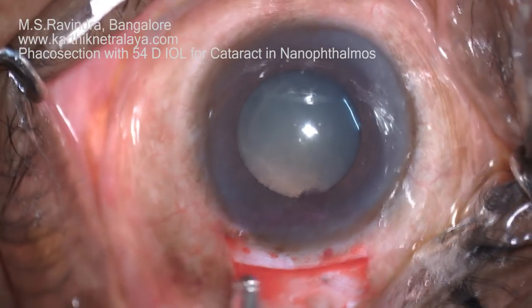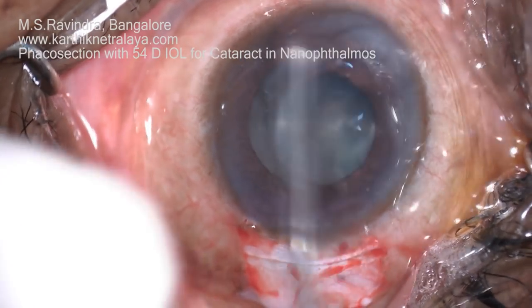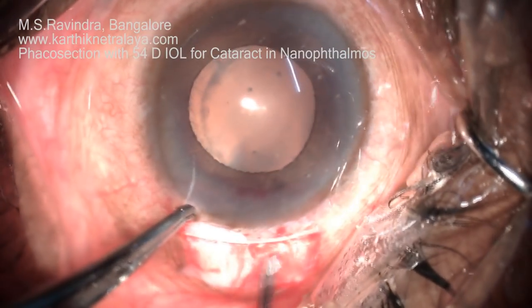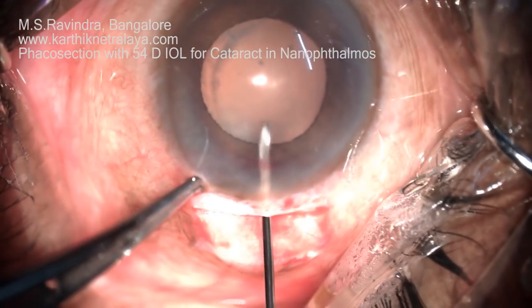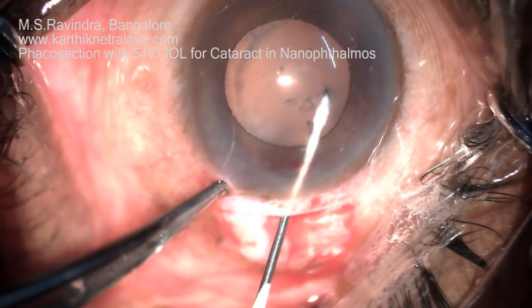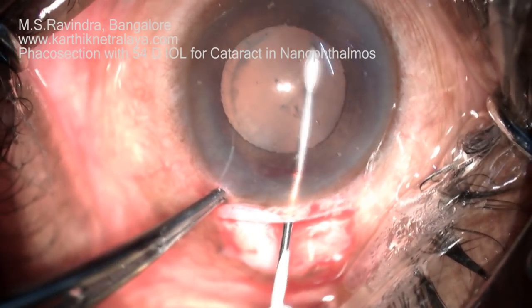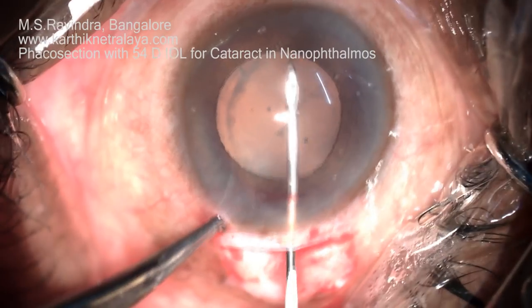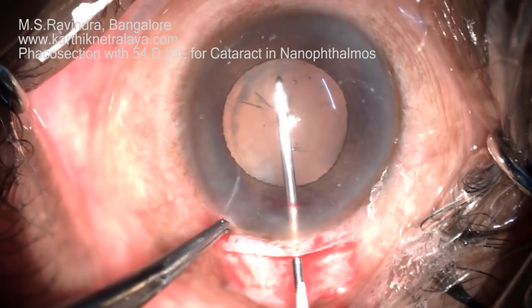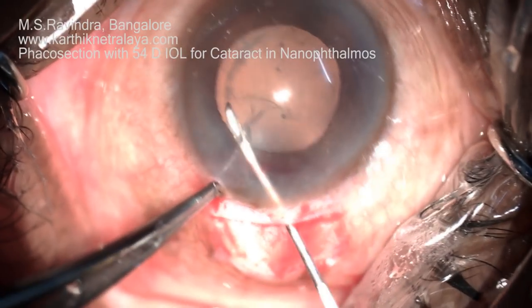The pupil does not dilate beyond this size in spite of putting topical phenylephrine and tropicamide. Retro-illumination with the tunnel floor entry technique is of great utility. The chamber is very shallow, but because of the tunnel floor entry technique it remains deep and formed throughout the surgery. A good rhexis can be performed, which is circular and of adequate size.